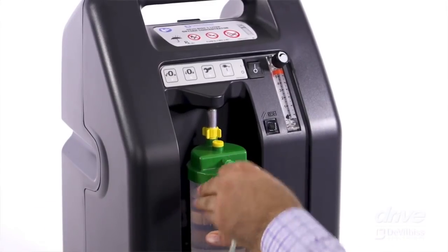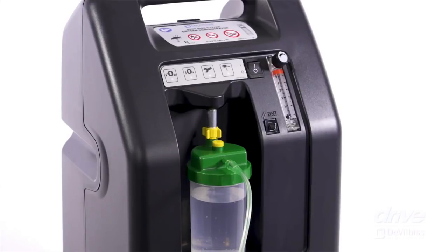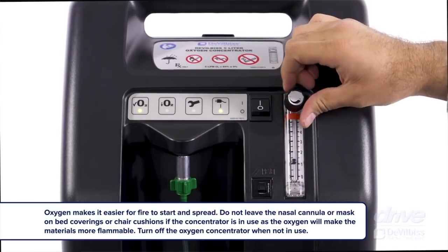There is also a device called an oxymizer, which can increase the oxygen flow rate. It concentrates the oxygen further and delivers a purer form, and is just one of the devices that can be used with the concentrator. Once the humidifier is attached, the oxygen tube is connected to the humidifier port, and that tubing is further connected to the nasal prongs the patient is using. We set it at the right level and check the patient's oxygen saturation with the pulse oximeter.